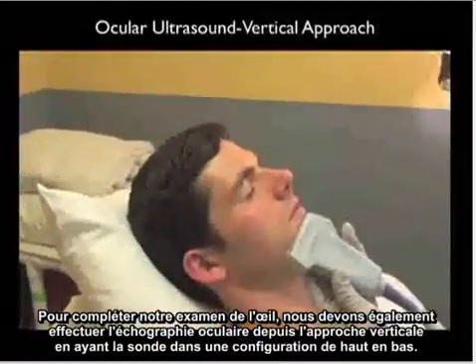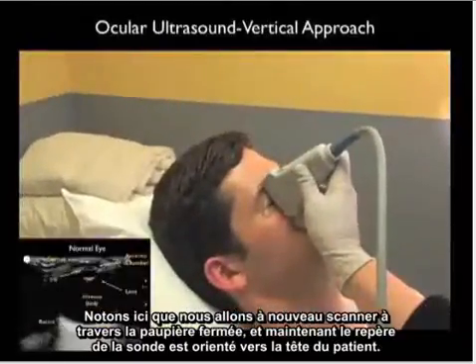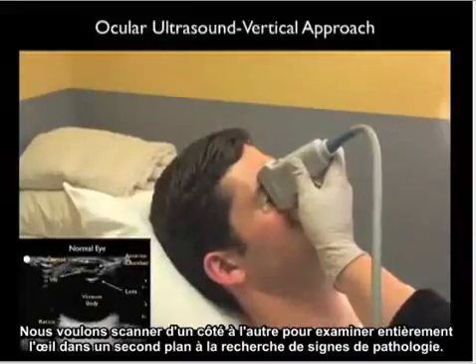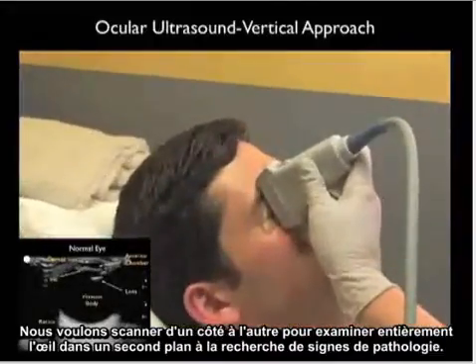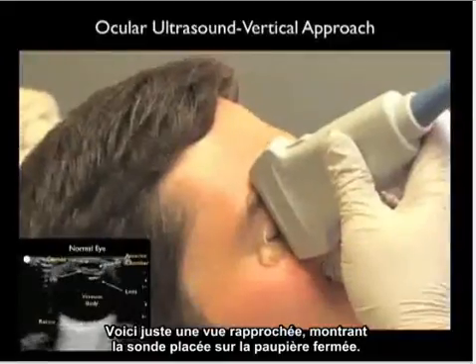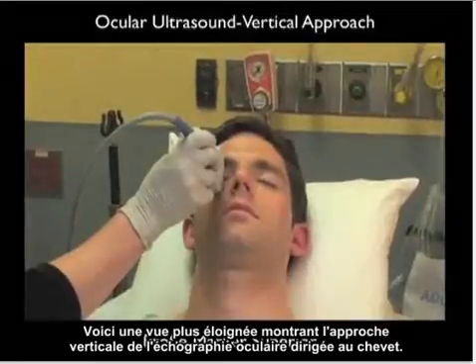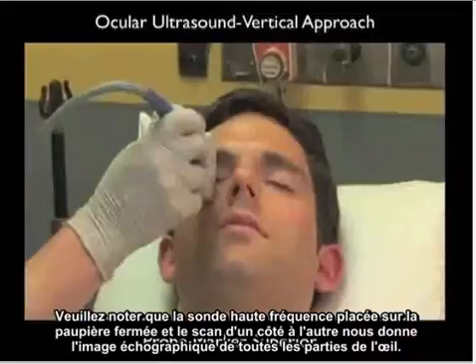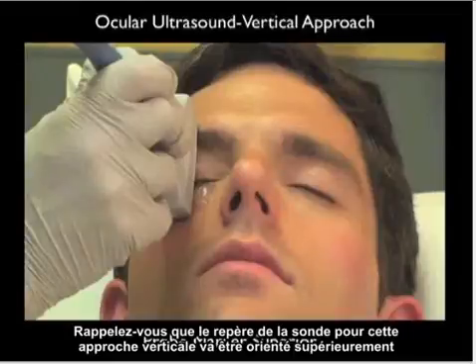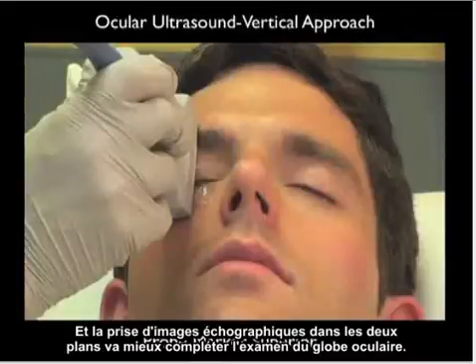To complete the examination of the eye, we should also perform ocular ultrasound from the vertical approach, with the probe in an up-and-down configuration, scanning through the closed eyelid with the probe marker up towards the patient's head. Scanning from side to side in this second plane allows us to fully investigate the eye for any signs of pathology. Imaging in two planes — horizontal and vertical — best rounds out the examination of the eyeball.